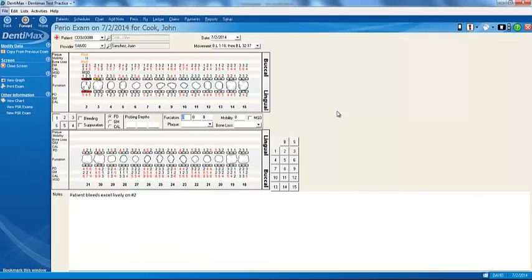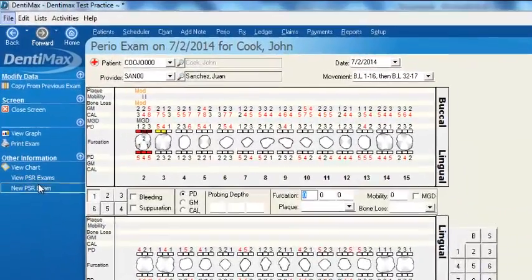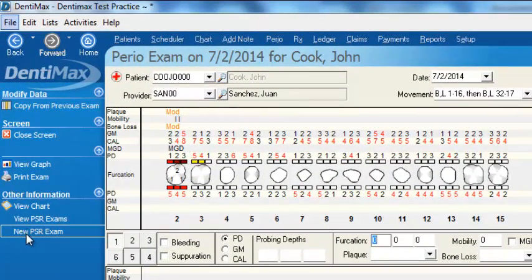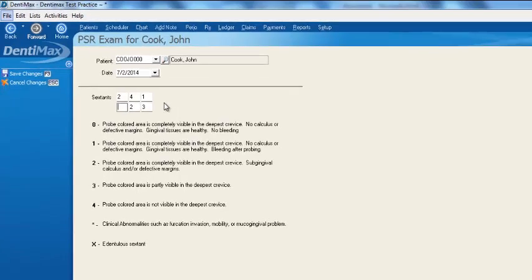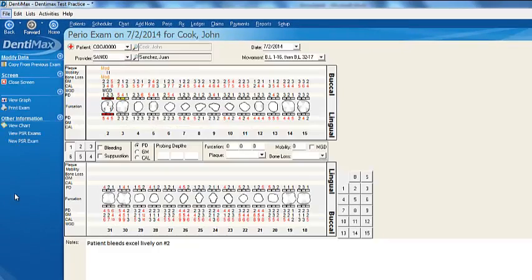Another thing you can do from your perio exam screen is quickly go to a PSR exam. Click on new PSR exam, and here you can do some pre-screening with patients, recording perio measurements by sextants — easily and quickly entering the average perio measurements for every sextant in the mouth. The perio charting screen is very comprehensive and extremely easy to use.